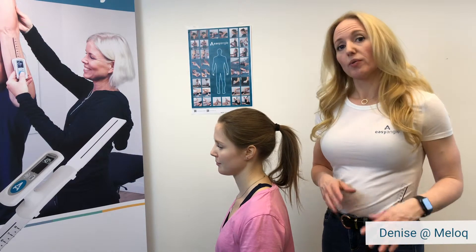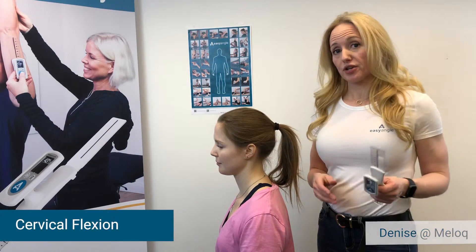In this Easy Angle measurement video, we're going to demonstrate how to measure cervical flexion.